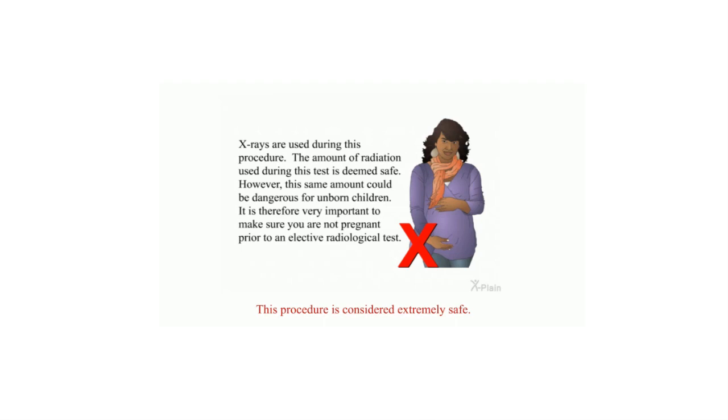X-rays are used during this procedure. The amount of radiation used during this test is deemed safe. However, the same amount could be dangerous for unborn children. It is therefore very important to make sure you're not pregnant prior to an elective radiological test.